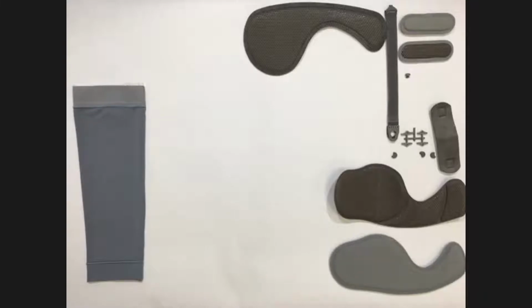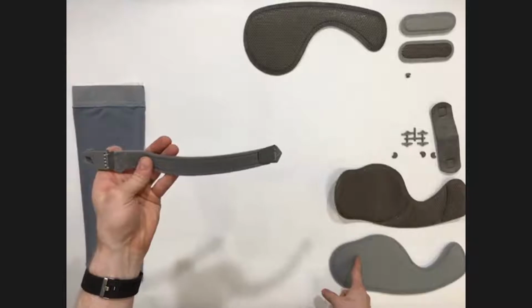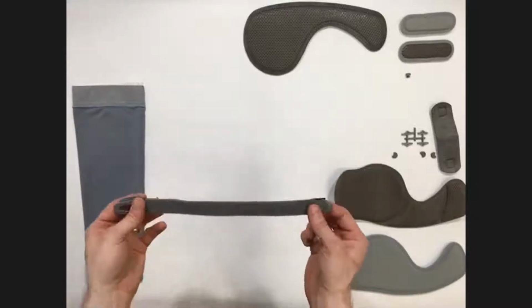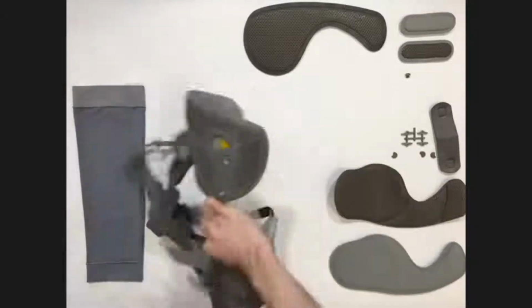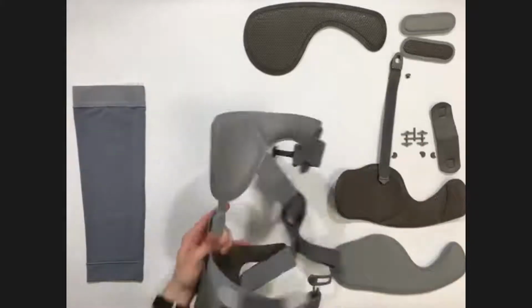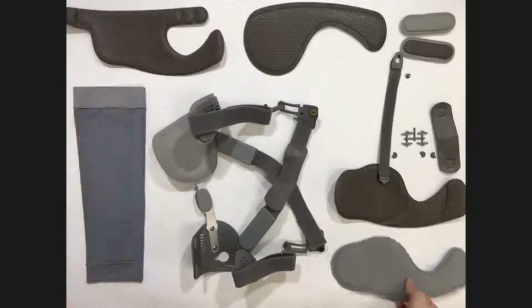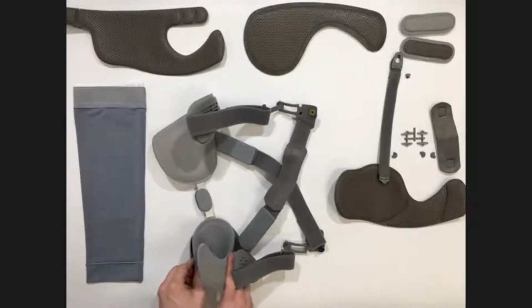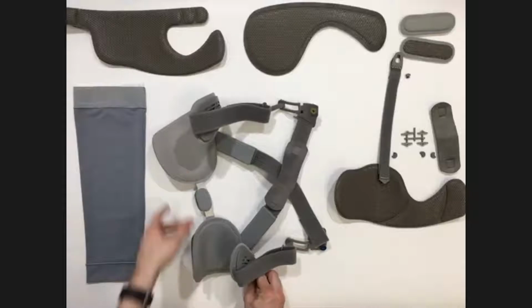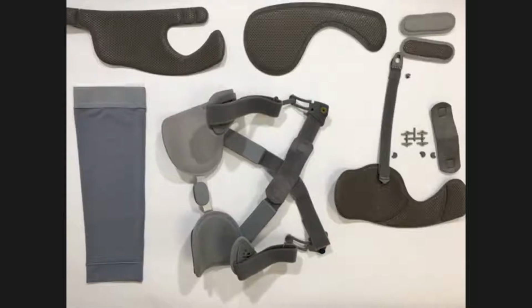With this, there's an extra kit that utilizes the frame in order to add a gastroc strap. So if we're wanting to use one of the doe skin liners like these, we need to add an alternative method of suspension. So with that, we bring our brace in, we remove our liner. In this case, we had the AMS wrap in there, and we can place in our doeskin tibial liner. This one fits into position either side, attaches in, and you can now see that we've got dual doeskin on both the thigh and on the tibial section as well.